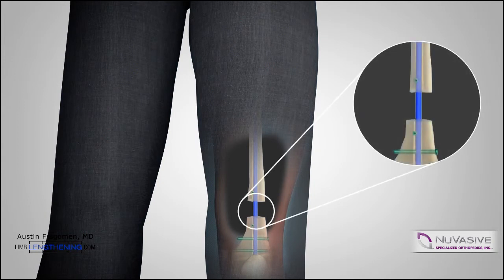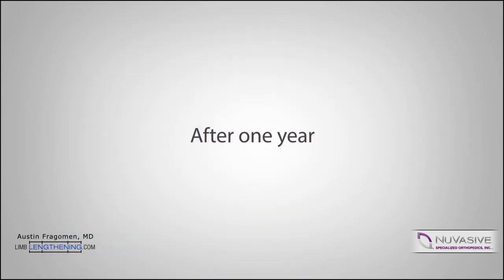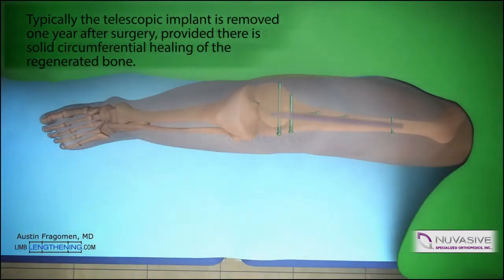We then enter the consolidation phase once lengthening has stopped. In this phase, the bone mineralizes and becomes very hard. Weight-bearing progresses according to the x-ray mineralization. The implants need to be removed, which can be done anywhere from 6 to 12 months after the original surgery. Implant removal is faster and a much quicker recovery for the patient.